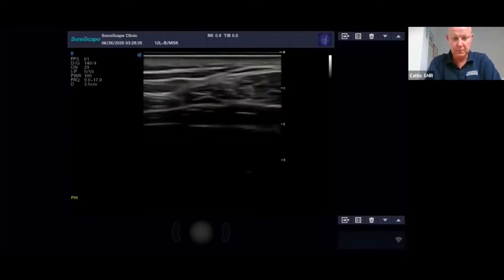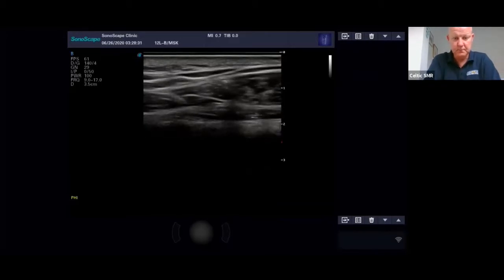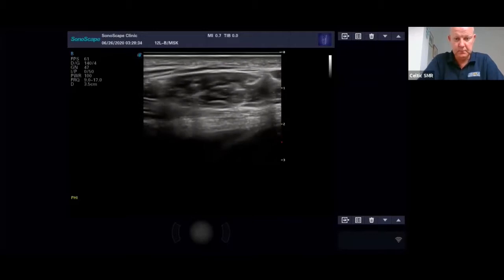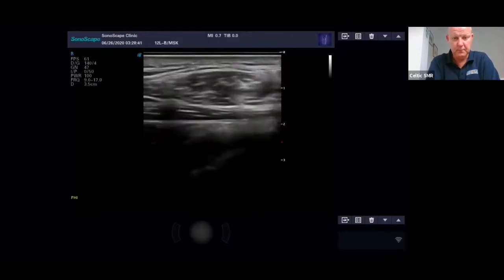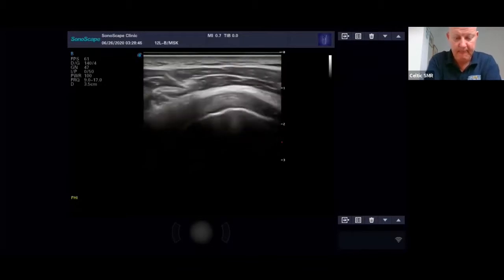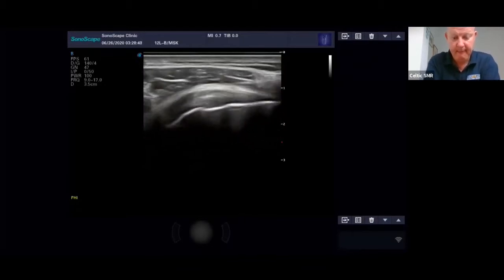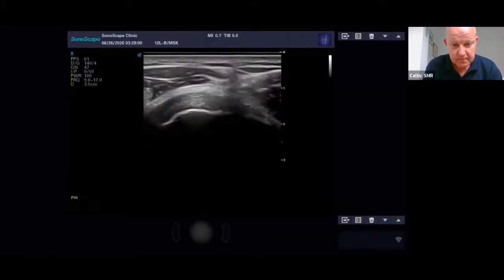So what I tend to do is come back into the muscle belly. I can take the focus down, probably increase the gain a little bit. Let me just freeze that. This here is the central tendon of the infraspinatus, which I'm going to follow around onto its insertion. And this thing we talked about before about anisotropy, this dark area here, you want to rule out that it is a tear or tendinopathy, and the way to do that is you just heel-toe.